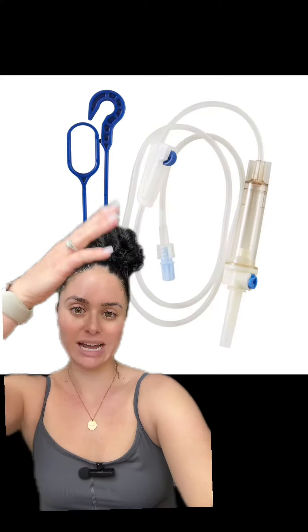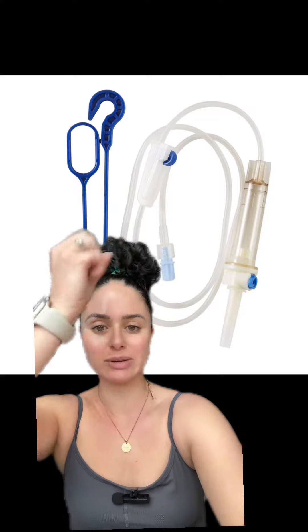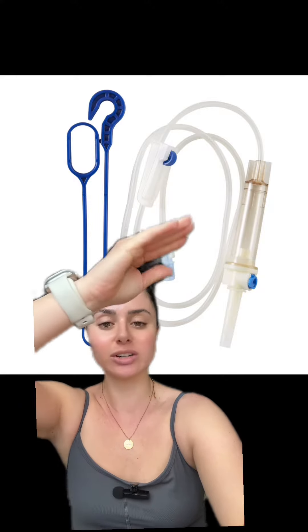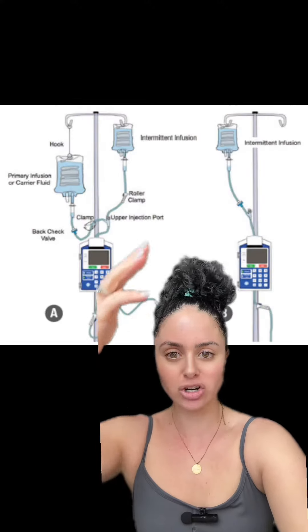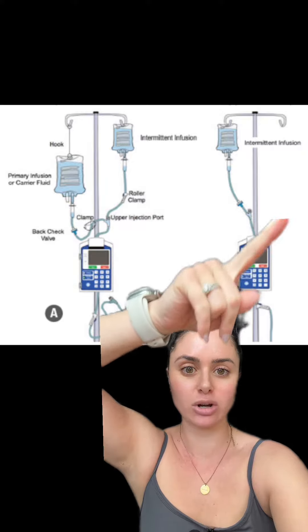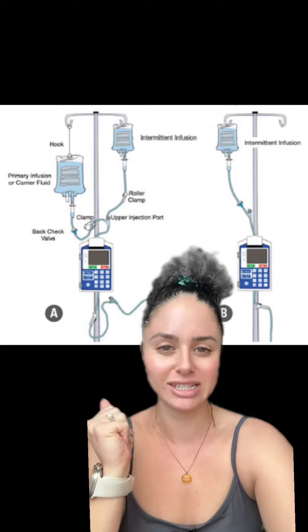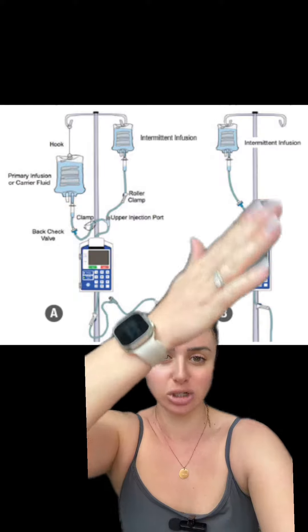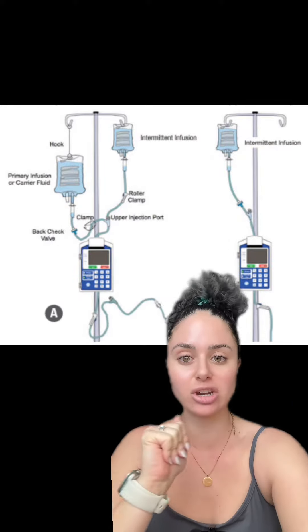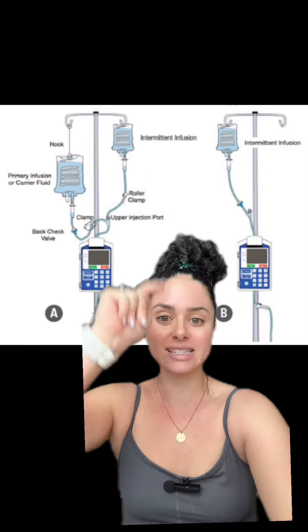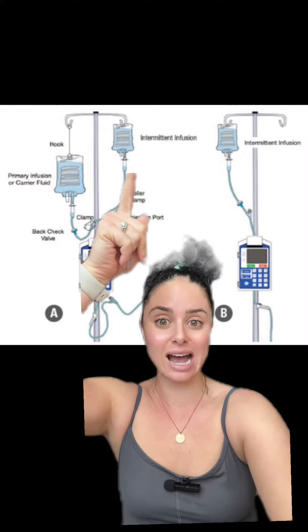Here's an example of some secondary tubing. When you grab a secondary set, it comes with a little hook so you can hang your primary bag lower, and the secondary set of tubing is shorter to connect to the primary. So here would be your continuous infusion — let's pretend this is your primary infusion connected to the patient — and this would be a primary infusion with a secondary. The secondary again is higher.